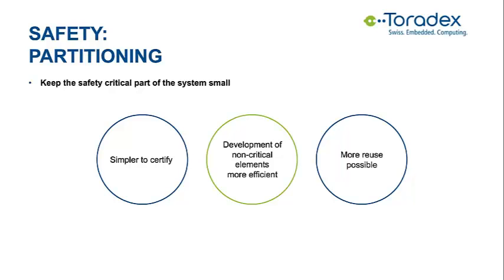Now, a little bit of change. On the next slide, I'd like to discuss some hardware design principles for safety critical devices. Toradex has many customers building devices, and here are some of the points on how they can achieve the required safety while keeping development efforts in check.